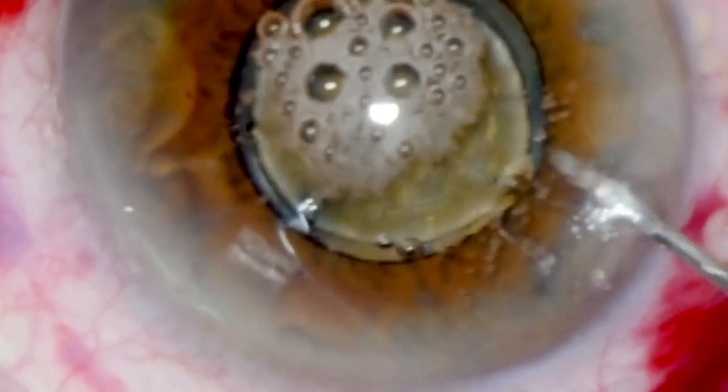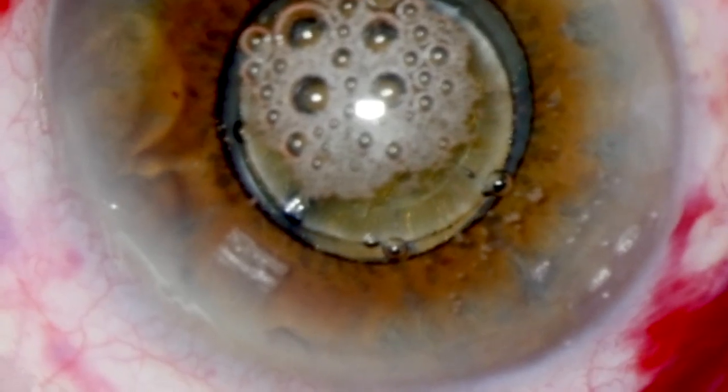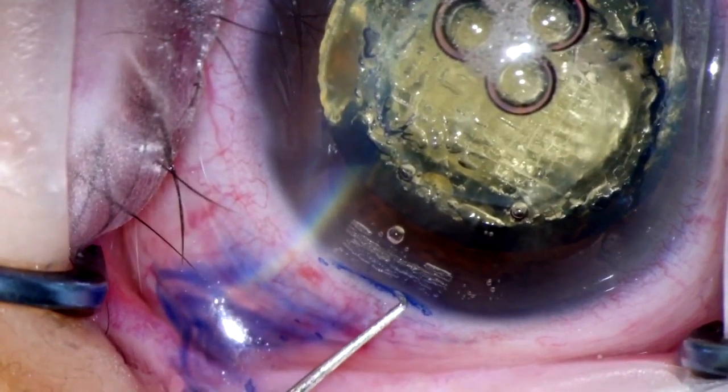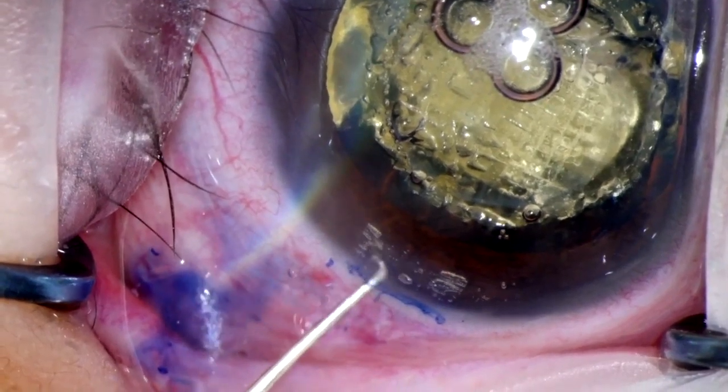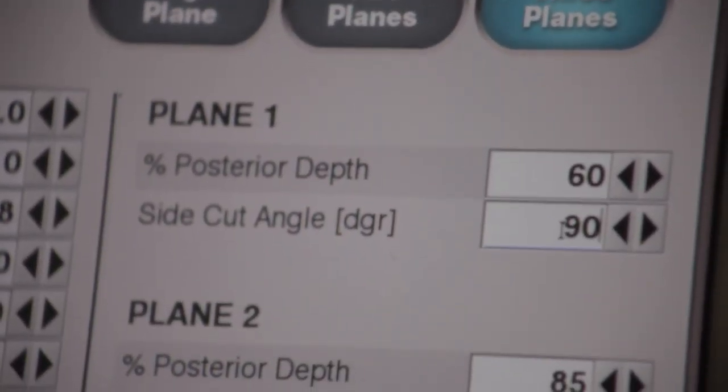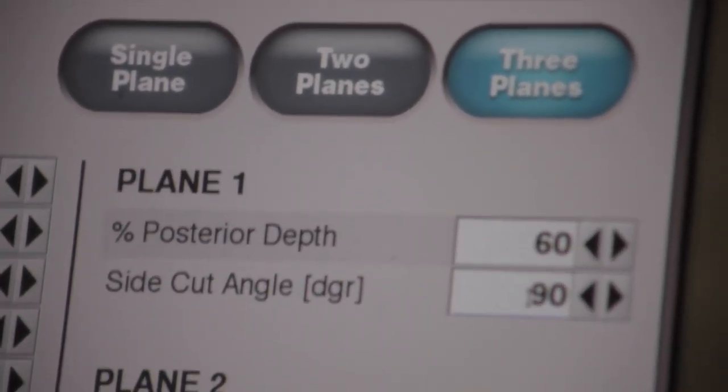The first plane is what we consider the most important plane. Application of the femtosecond laser leads to what may be called a velcro or a zipper effect. This demands the use of blunt instruments to open the incisions. The fitting of a blunt instrument, such as a spatula or a Sinskey hook, into the first, deep plane does allow for fitting into enough space, leading to opening of the tissue. The depth of our first plane is 60%, which makes this easier.